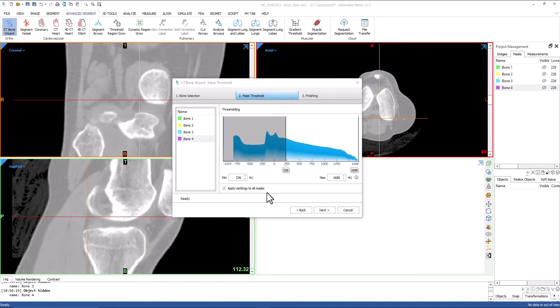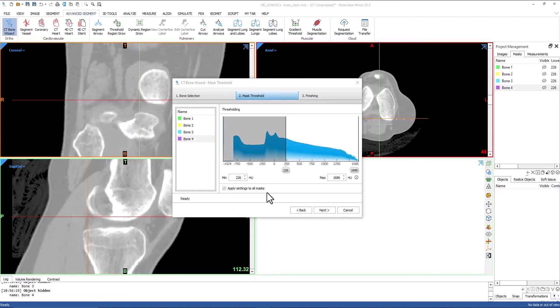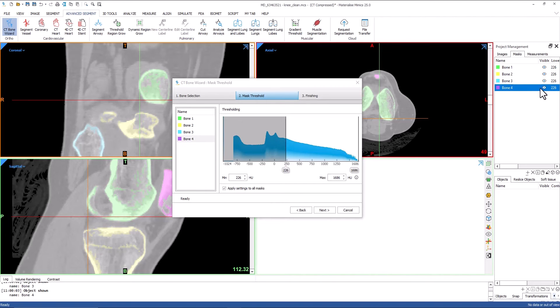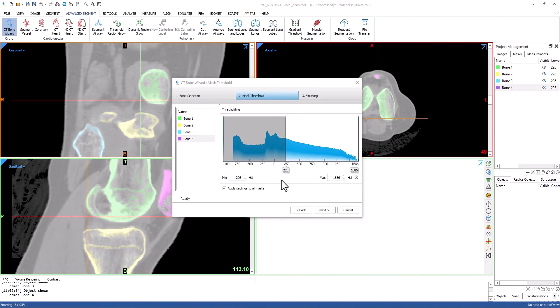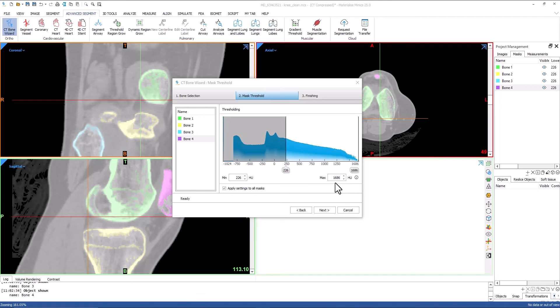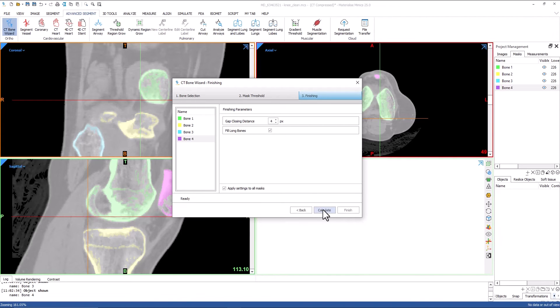The second step of the CT Bone Wizard is to define an appropriate threshold range. This can be defined once for all bone masks or individually per mask. A preview will be shown during this step. I will use a minimum of 226 Hounsfield units and a maximum of 1686 Hounsfield units and apply the range to all bone masks. I will now click next to move on.